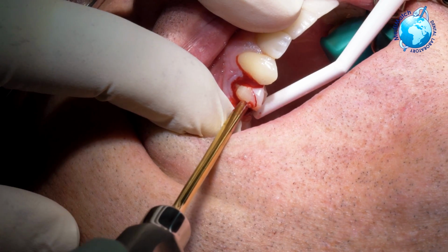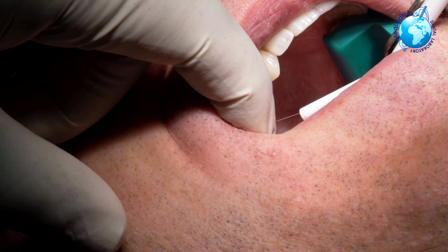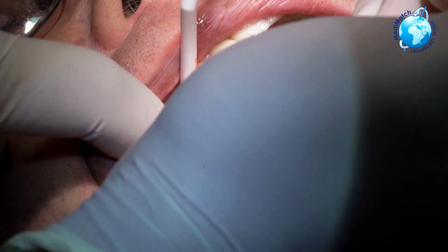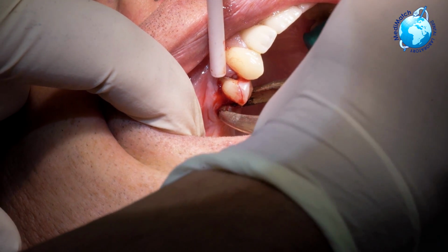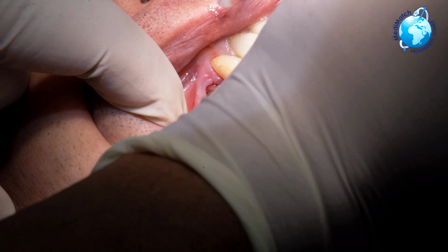Just clean that up. You can see a little fracture of the tooth there. Suction for me. Root forceps, please. Root forceps? Yeah, got it. Okay, just pull it down. Okay, so this is quite an infected site, so I'm just going to deliver that. A little bit more manipulation.